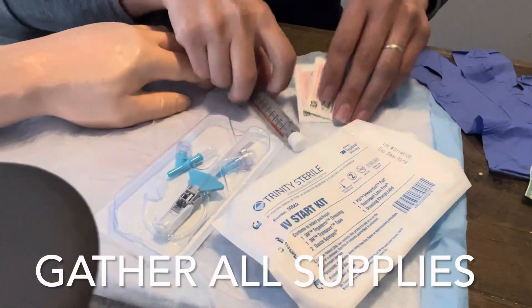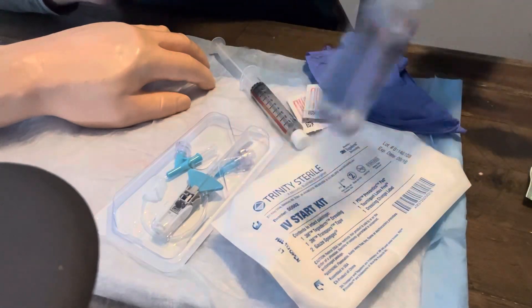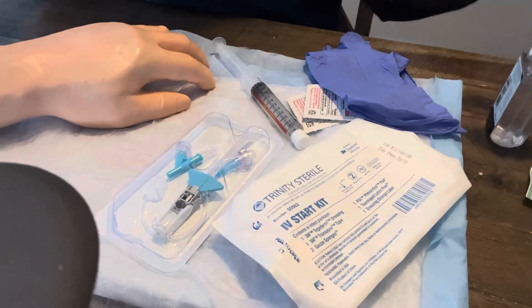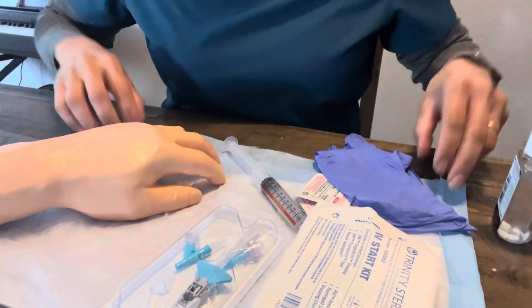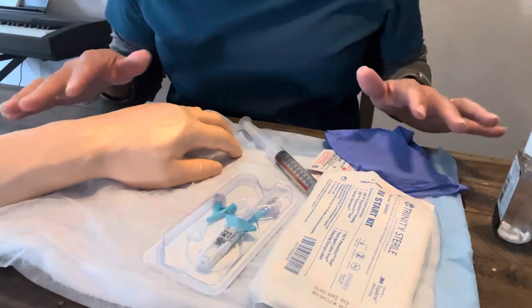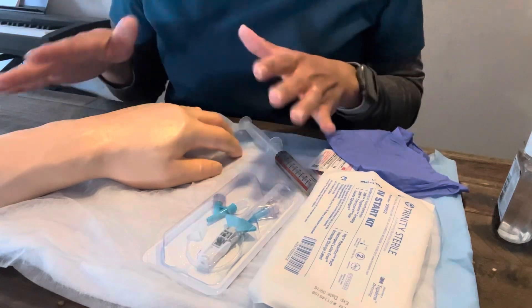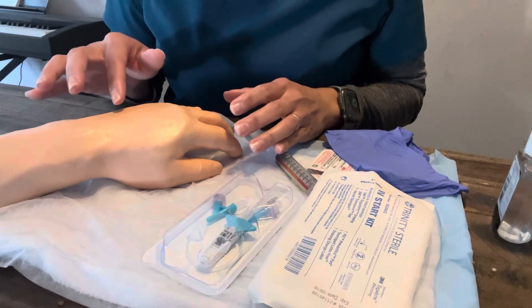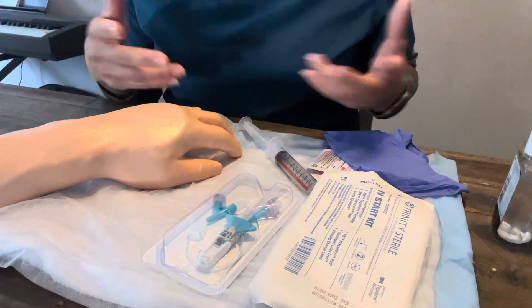We have our order, our supplies, a flush, alcohol, gloves and sanitizer, and our patient with an order to insert the IV. One thing I tell my students: before you even go to poke the patient, get all your supplies set up first. Prior to starting the insertion process, make sure you have everything ready because you don't want to have to leave the room and come back — it just adds more time.